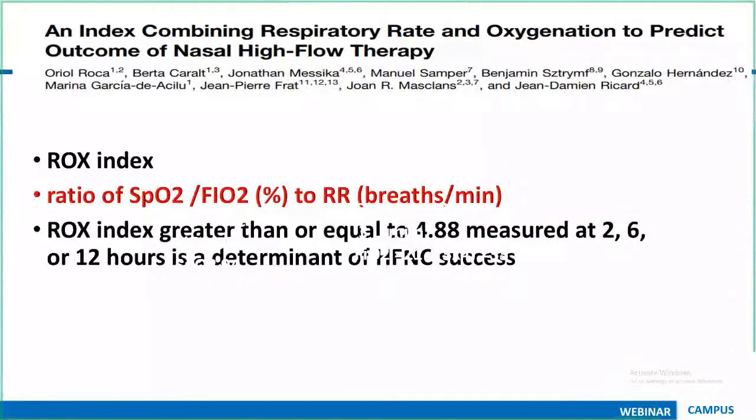Then I asked, and they told me he had been like that for 5 days. When we shifted that patient, we could see extensive lung damage. Whatever treatment you give to such patients, it is very, very difficult to rescue them. So please don't unnecessarily prolong intubation and keep your patients on NIV. Now coming to NIV tolerability, how will you see?